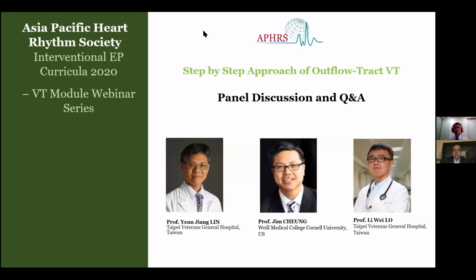Great. Well, that's a great case. I think it's almost like for AF ablation, it's a stepwise approach. You have to do PVI, then lines and lines. And I really am convinced that you had to do all those different spots to eventually get it. I think you just kept chasing the exit and then you finally got it.